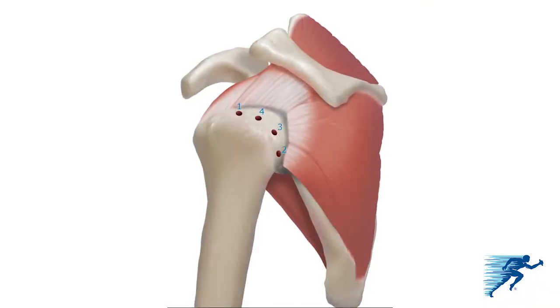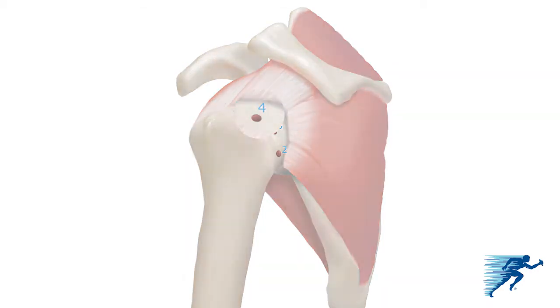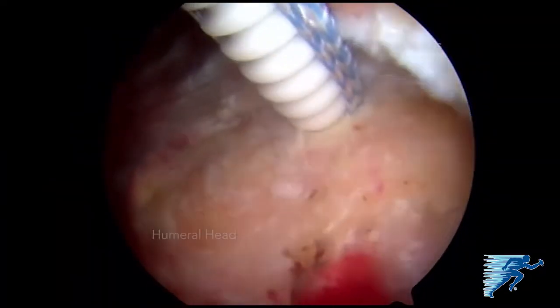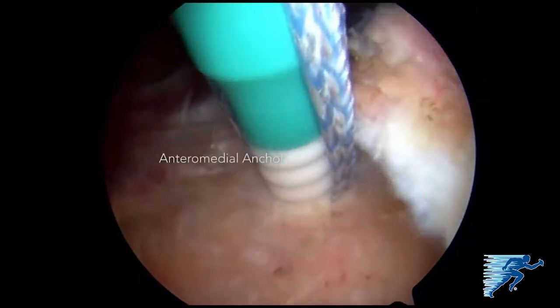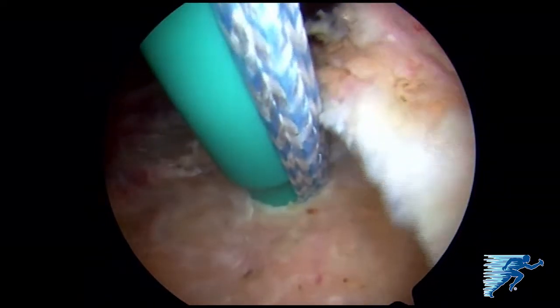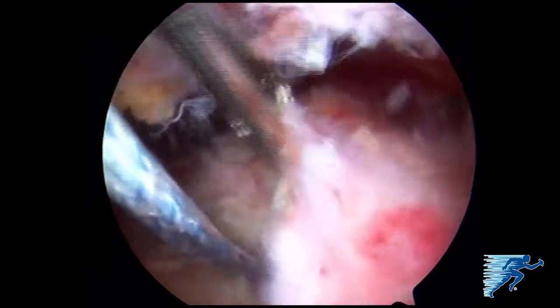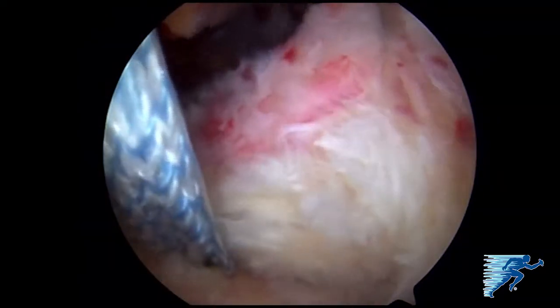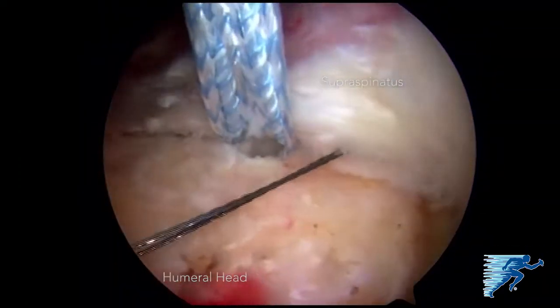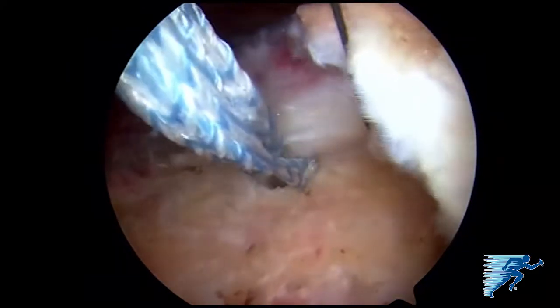The initial anchor is placed anteriorly and the second anchor placed posteriorly. Working from outside in helps avoid the formation of dog ears. Four 4.75 millimeter biocomposite swivel lock anchors loaded with fiber tape are placed medially in the rotator cuff footprint adjacent to the articular cartilage margin of the humeral head. We grasp the tendon and pass through with a 90-degree straight suture lasso, then shuttle the fiber tape sutures back through the tendon.